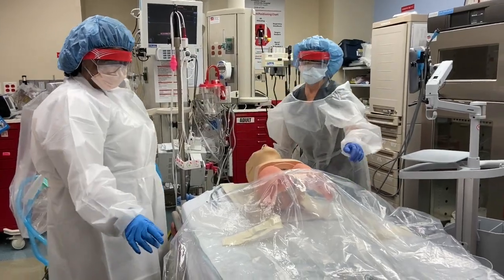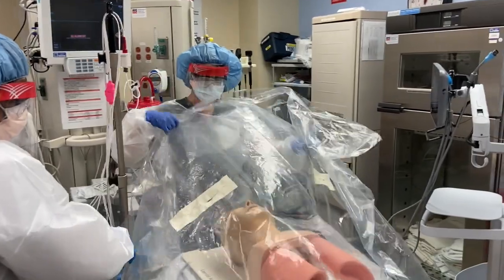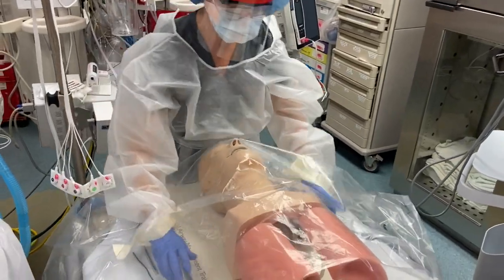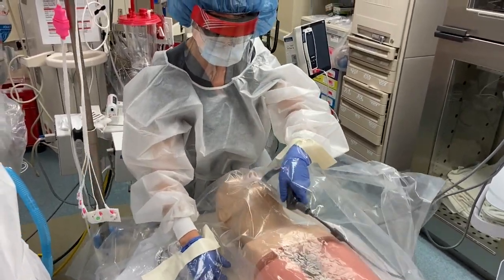After the patient is induced and completely paralyzed, the drape is drawn over the patient's face and head. There should be ample material from the drape to protect the operator and the respiratory therapist, and there should be enough material above the patient's face to allow for laryngoscopy.